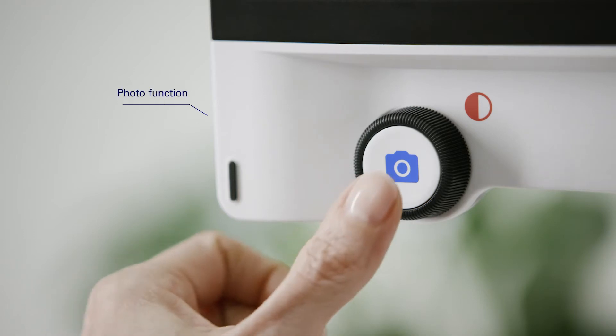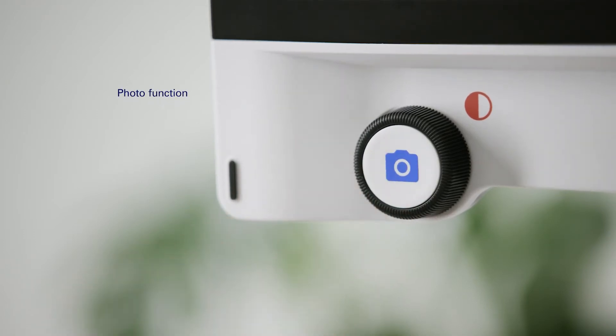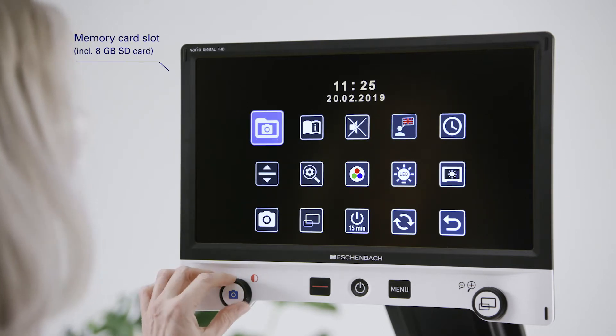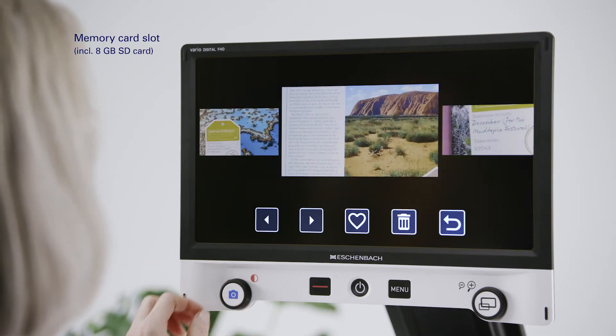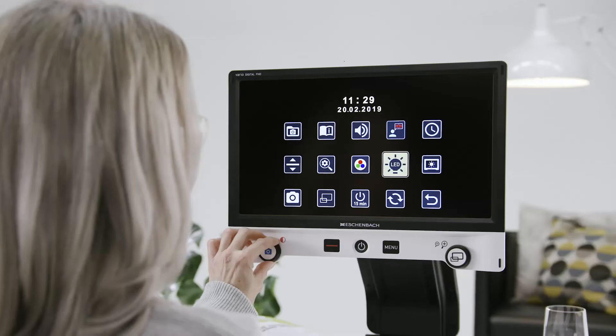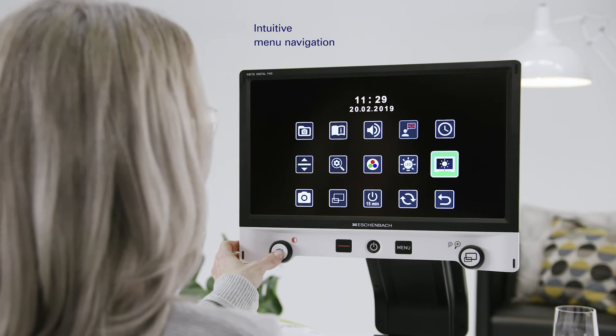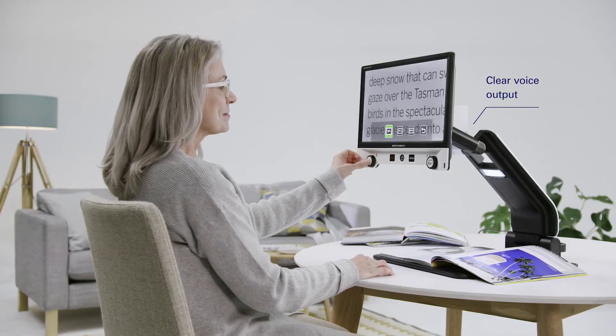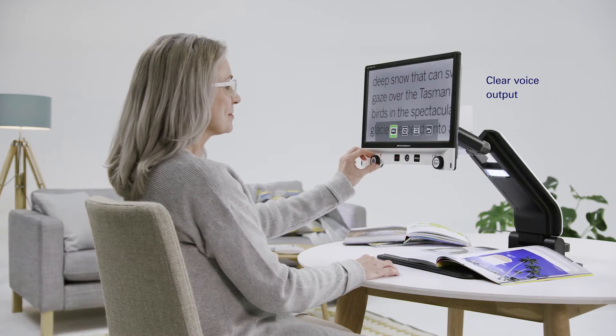The photo button is used to create photos from the selected image section, and these photos can be saved on an SD card and retrieved via the menu. Other personalized adjustment possibilities such as screen brightness, display brightness, or voice output of the menu navigation enable you to adapt the device to your needs.